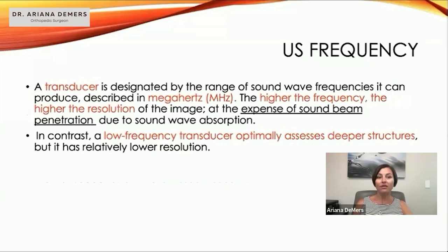And so the higher the frequency, the more clear you can see it, but the depth is not going to be as accessible. With the low frequency transducers, you are able to assess those deeper structures, but at the expense of resolution. You have a lower resolution picture.